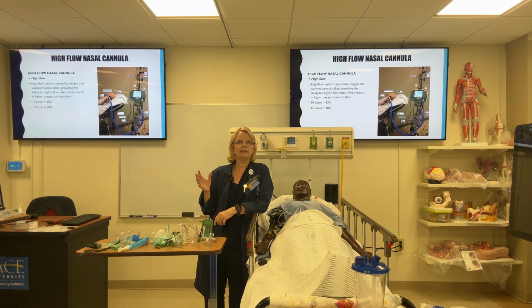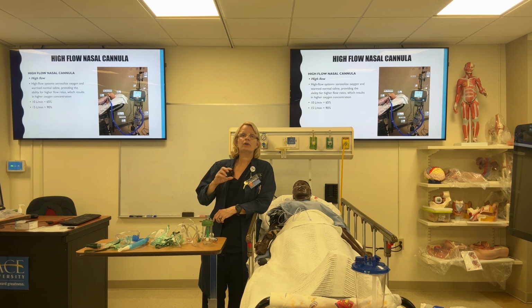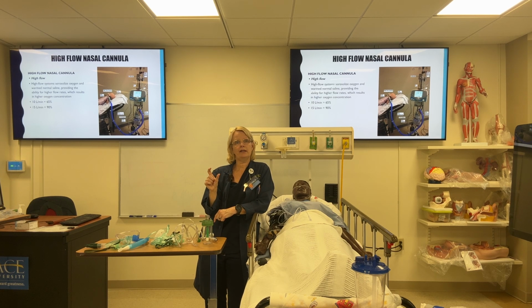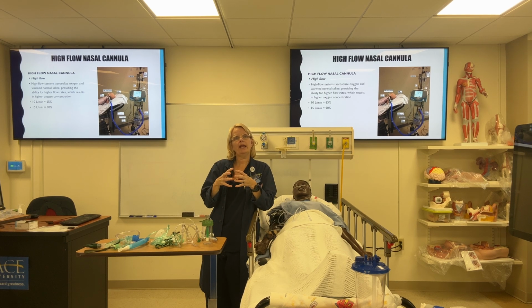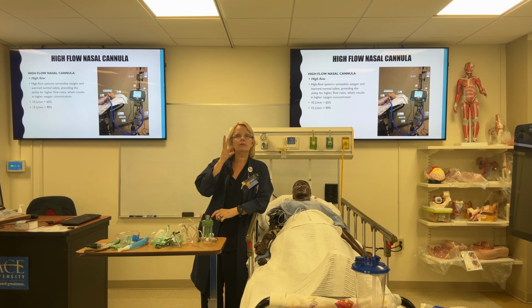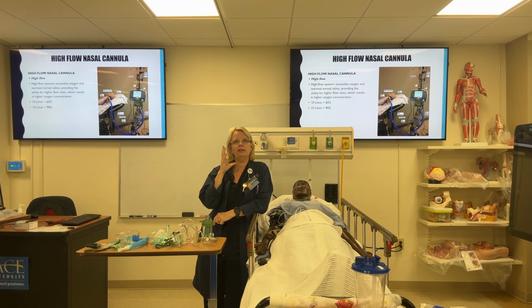A high flow nasal cannula is like a regular nasal cannula, except there are a few things that are required. If you're going to be putting the flow rate on a high flow nasal cannula up to 10 to 15 liters per minute, this device specifically requires 2 things. It requires humidity and it requires heat. When respiratory comes and sets up the high flow nasal cannula on your patient, it comes with a warming element and a humidification element so that the patient's nasal mucosal membrane does not get completely dried out.